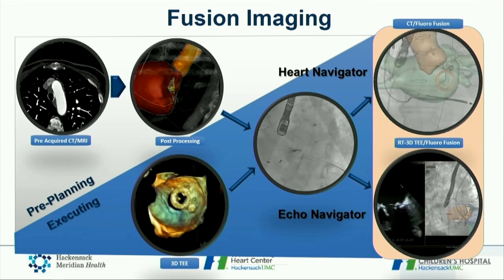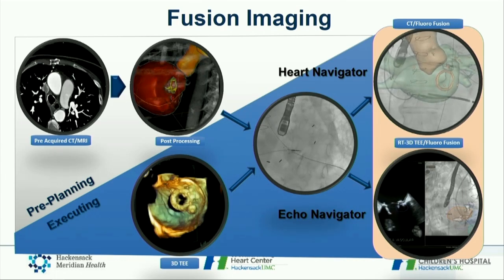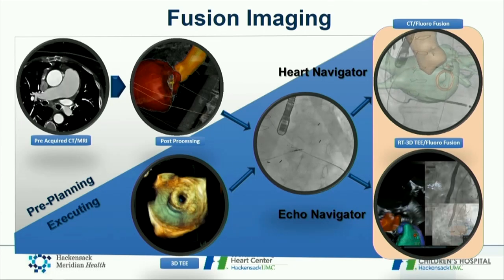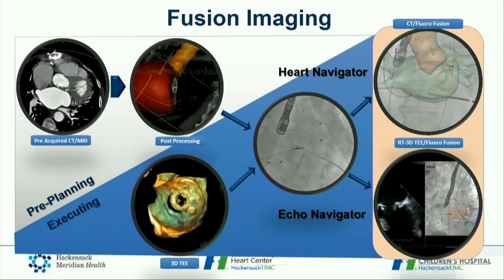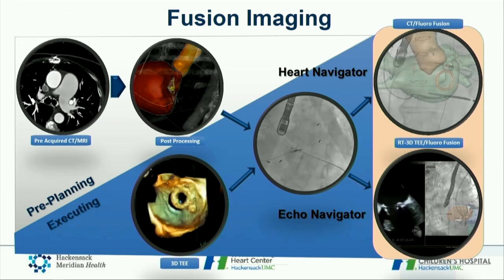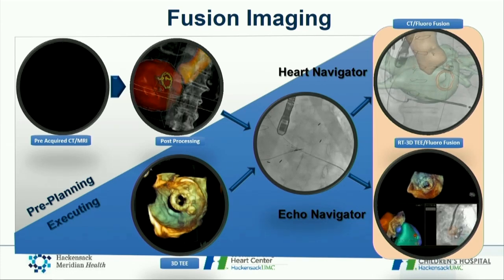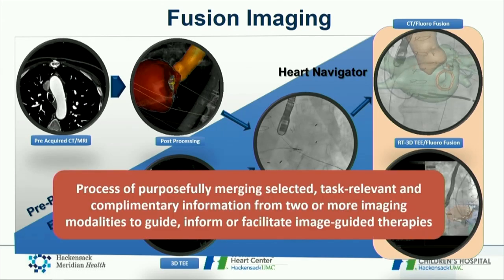And one of the most used modalities, the TEE, is very useful, but has a small field of vision, and also needs better spatial and temporal resolution. Especially if you're looking for wires while doing the procedures, they can't be well visualized. So in essence, there is not a single modality that can give you all the information while doing these procedures, and that's when fusion imaging plays an important role.